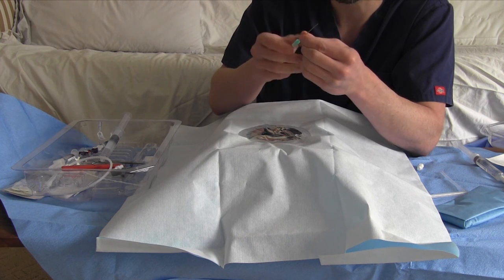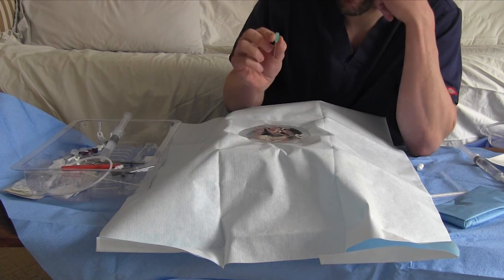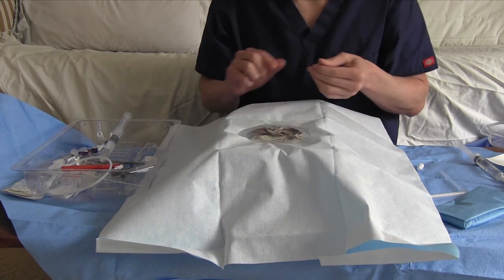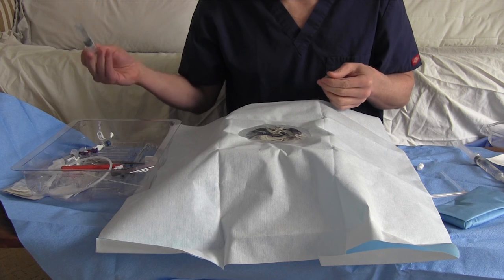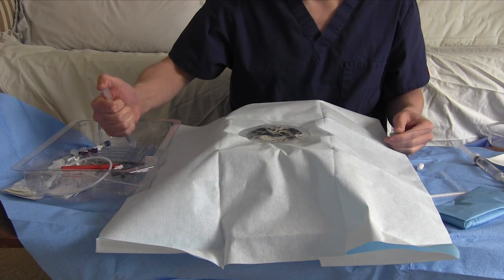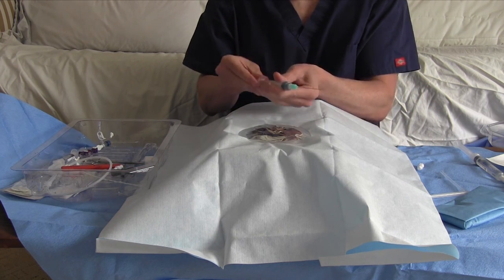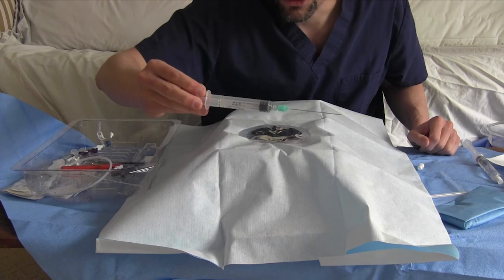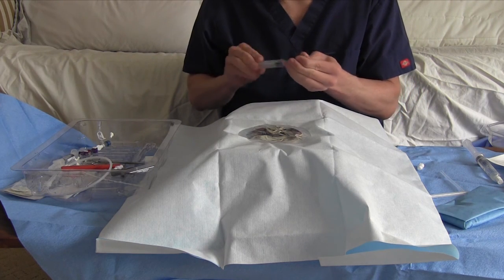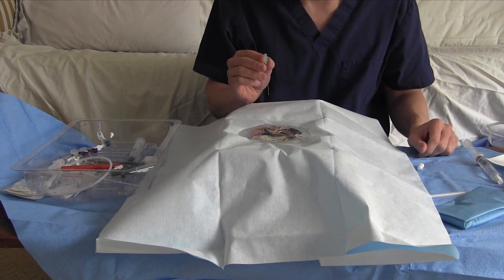They do have an echogenic collar, so they show up nicely on ultrasound. And I think they're built not to have a syringe attached. Most people probably won't. If you want to use a syringe, then just take the extra saline flush, empty it out into your kit, and attach that. And now you have your needle syringe assembly. But if you're using ultrasound, you might want to go without a syringe because then you'll actually see the flash.